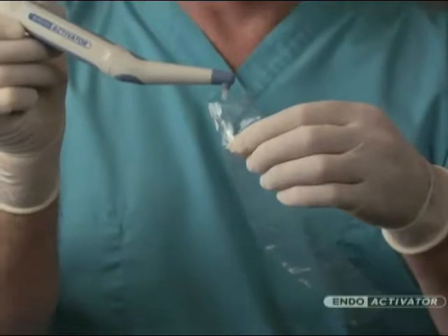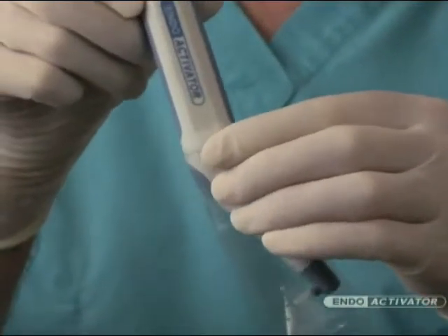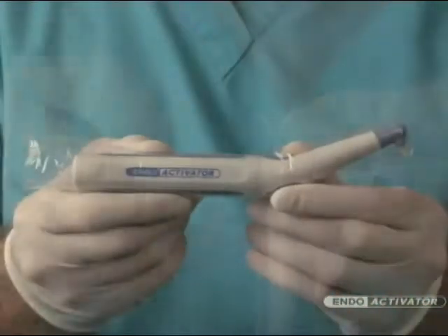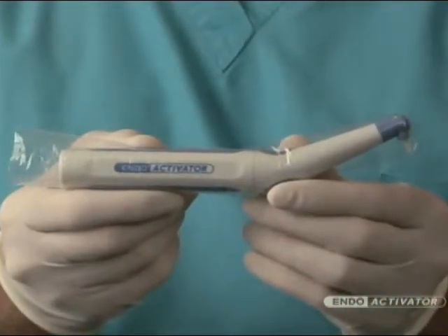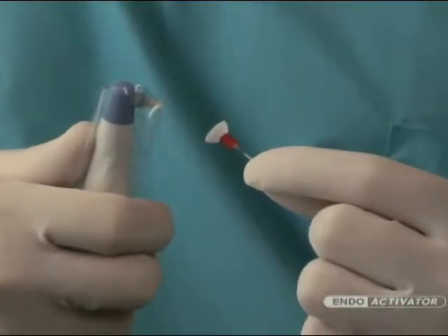Now that you are familiar with the Indo-Activator system, let's look at the clinical guidelines for infection control. Place the barrier sleeve over the driver to protect the entire handpiece. Importantly, attach the activator over the barrier-protected driver.